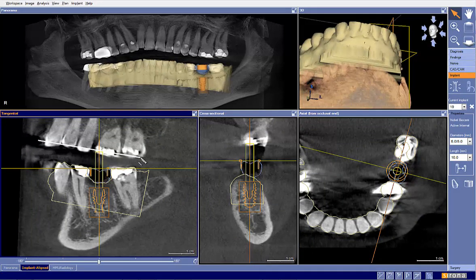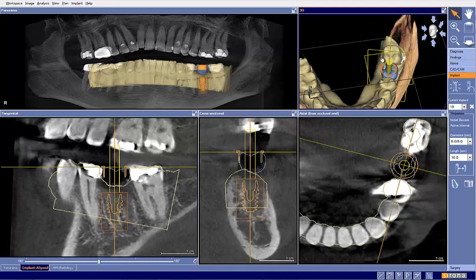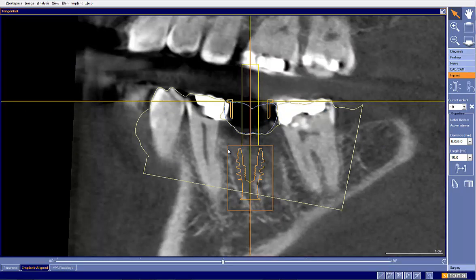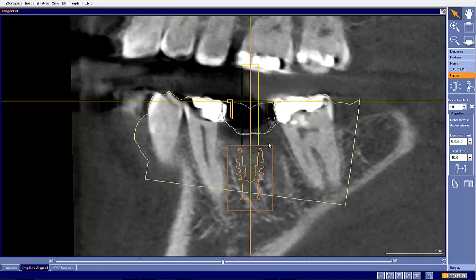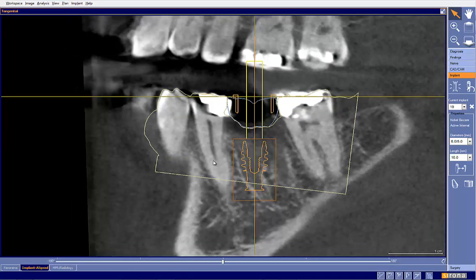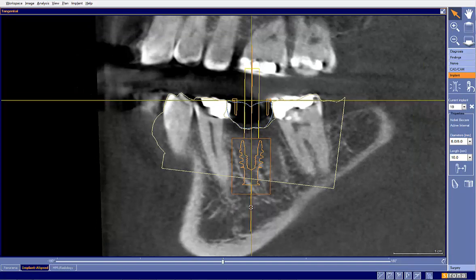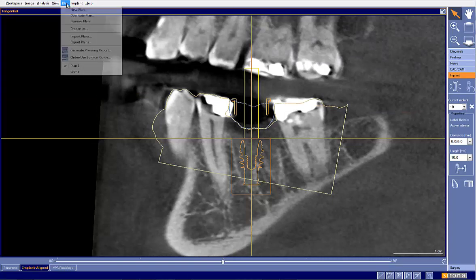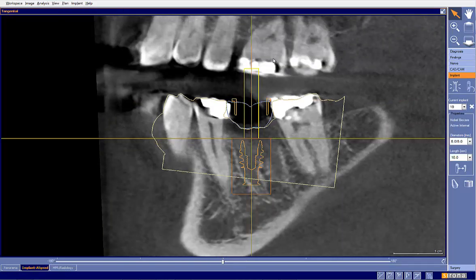Okay. Next would be our occlusal plane, and this is where I see a common error. If we look, your upper teeth are like that, your lower teeth are like that, and that's not really exactly what we want. So in this particular case, I would need to tilt this a little bit like that. Remember I talked to you earlier in the video about having less space on the mesial versus on the distal. So when we tilt this, that will actually give us a better emergence overall. So we'll tilt this a little bit more, and just like that. Technically I could probably tilt this a hair more. Now let's take a look at my plan versus the original plan, and you can see the slight difference there.